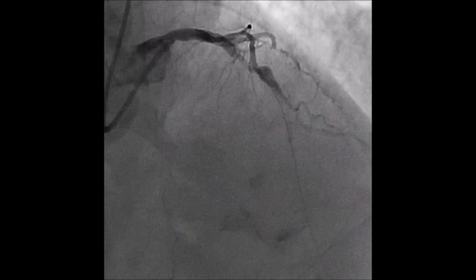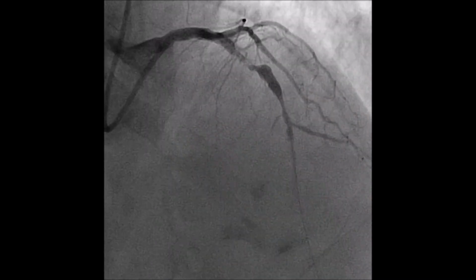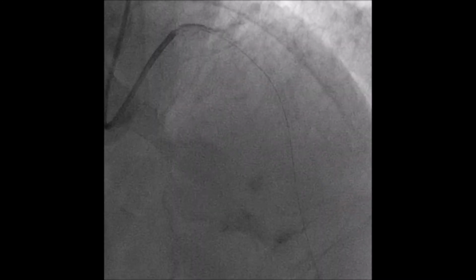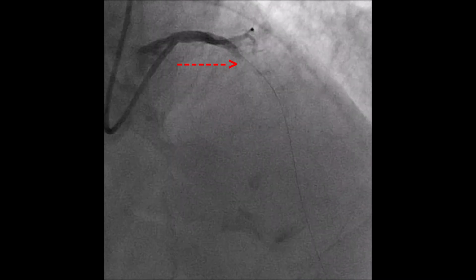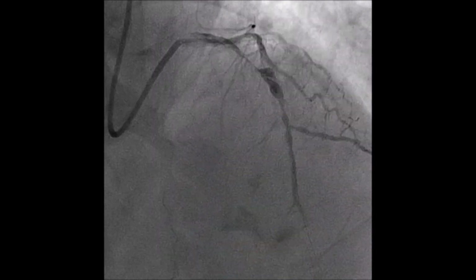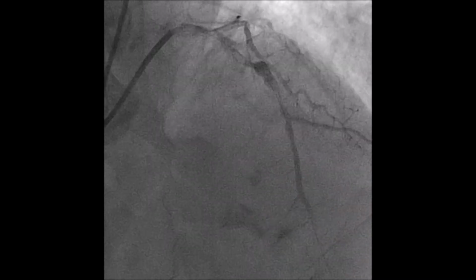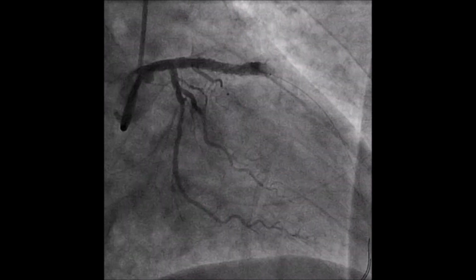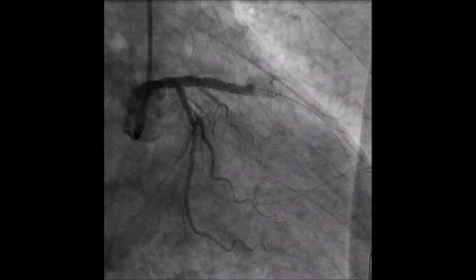Sometimes, as in this case, passing the guide wire partially opens the artery and allows us to see part of the distal bed. In this case, it is evident that the anterior descending artery is very ill and full of thrombus, presenting ectatic segments that alternate with segments with stenosis. For this reason, and with the intention of avoiding the mobilization of the thrombotic content, a direct implantation of a drug-eluting stent was made. Unfortunately, almost immediately, a no reflow phenomenon occurred.